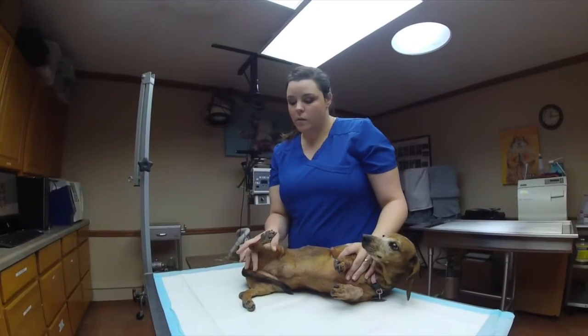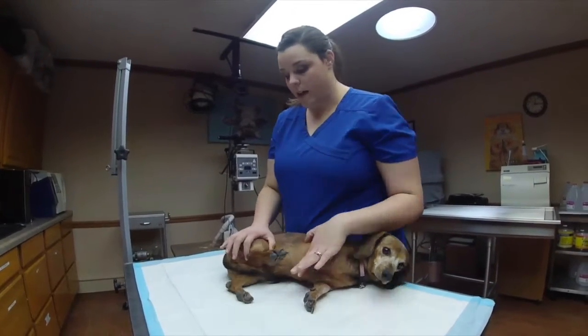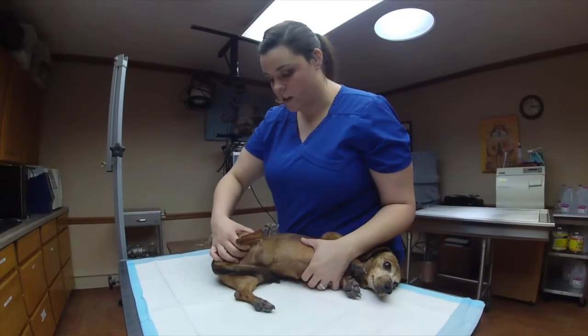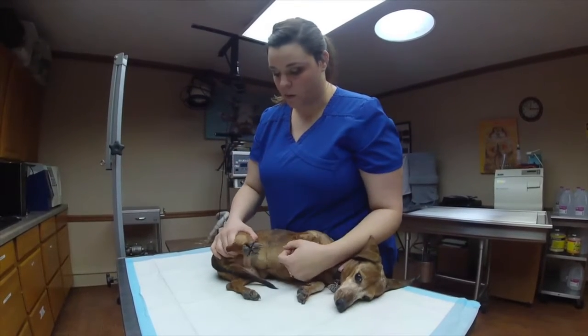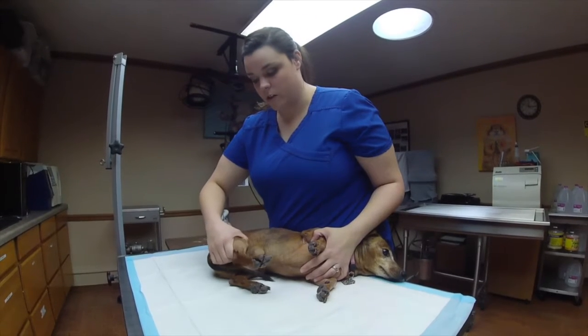Okay, to draw blood from the saphenous vein, you're going to hold your animal on its side and you're going to apply pressure. You may have to have the person drawing the blood pull their leg out, and then apply pressure or a tourniquet.